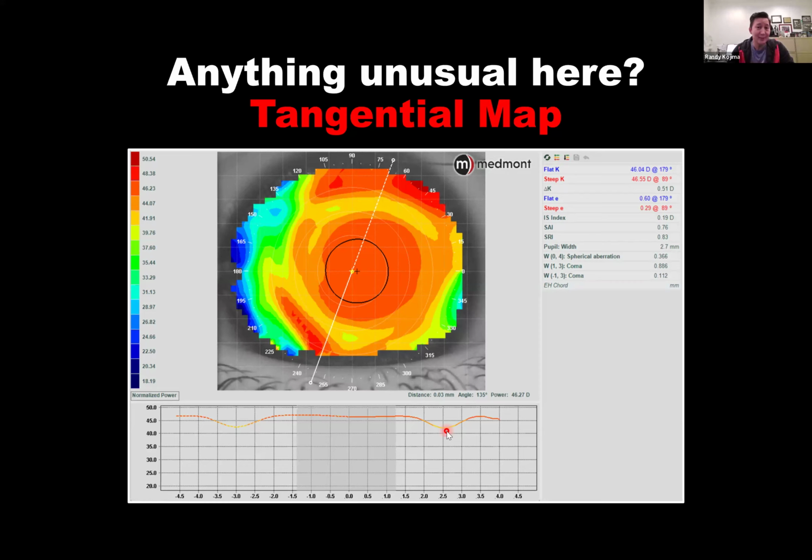So clearly we can see where the contact lens was putting its pressure on the eye. Y obviamente, como pueden ver aquí, esa es la parte buena de tener un topógrafo, que el topógrafo nos dice qué está sucediendo. Como pueden ver en el área inferior, vemos que hay dos pequeños valles, uno opuesto al otro, eso es superior e inferior, bastante claro en el centro, y esos dos pequeños valles donde hace presión el lente, y por eso la indentación.